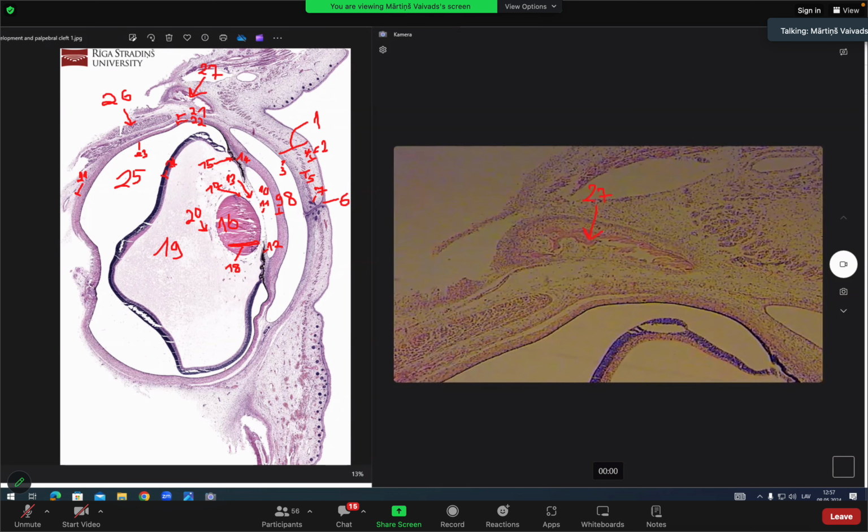And in the eye region, it's interesting. You can have both intramembranous ossification and endochondral ossification. It depends on the slide and the location. You might even see cartilage. So in this slide, you see bone tissue, but we will check some other slide pictures. You might see cartilage even there.